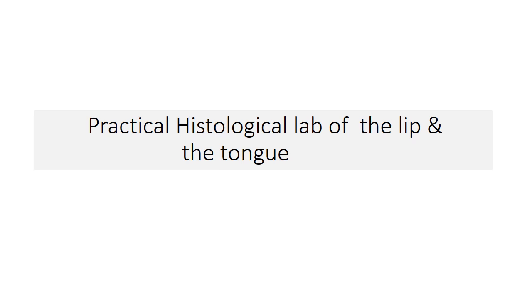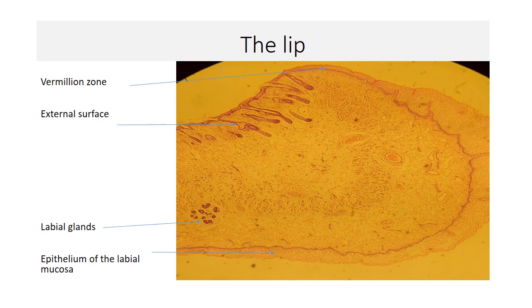This is a practical histological lab of the lip and the tongue. Starting with a section of the lip. Here, the first part or external surface of the lip is represented by the skin.